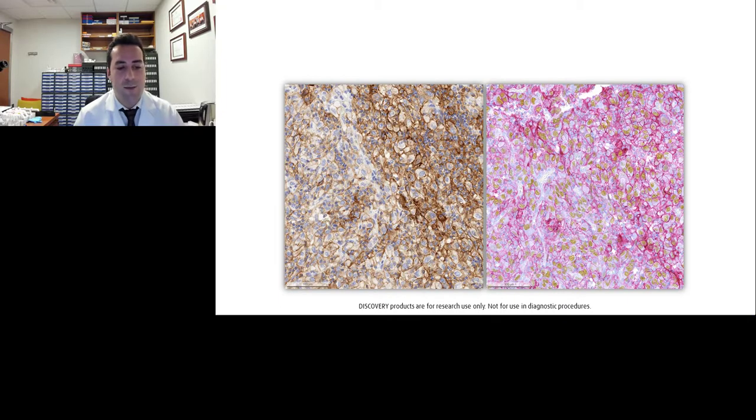Another case with moderate staining. Red staining is moderate in intensity likewise. The same subpopulation, however, on the left side seems somewhat paler in both stains. This is partially because of the infiltrating lymphocytes, which can easily be recognized and ignored with TTF1 and cytokeratin negativity in the triplex design.